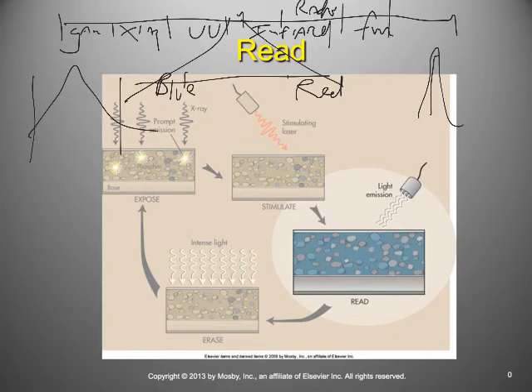Now the significant thing from the standpoint of the reader is it's reading this light emission from the PSP into what we call an analog to digital converter, an ADC. And this is essentially the same thing as what's going on inside of a CT DAS, the data acquisition system. I have an analog signal of light, and I'm digitizing it, period.